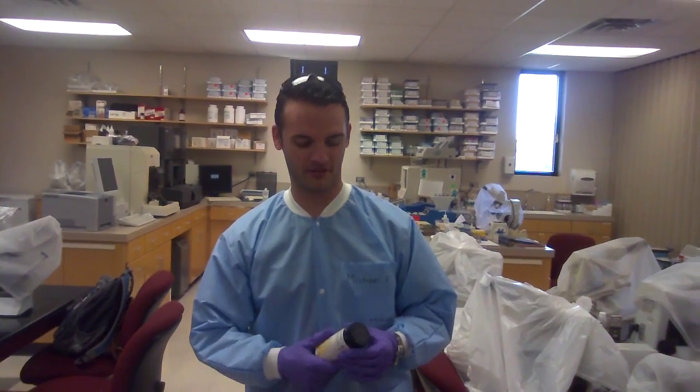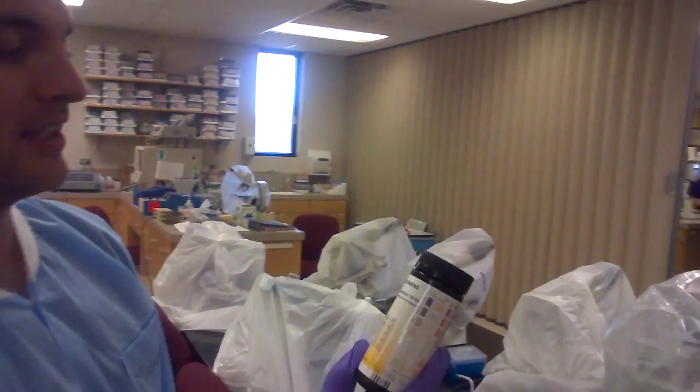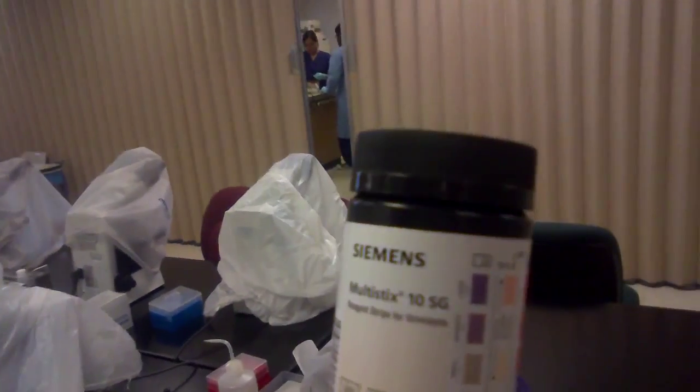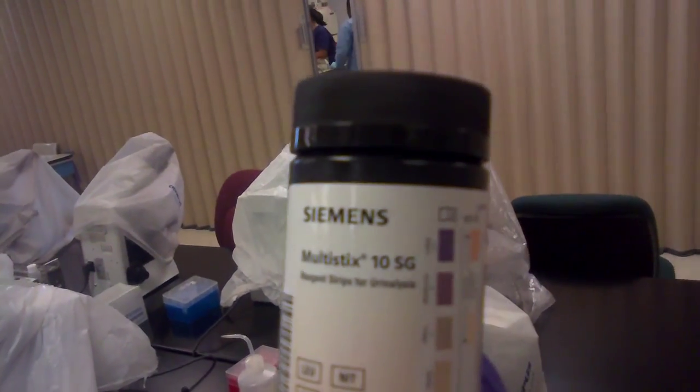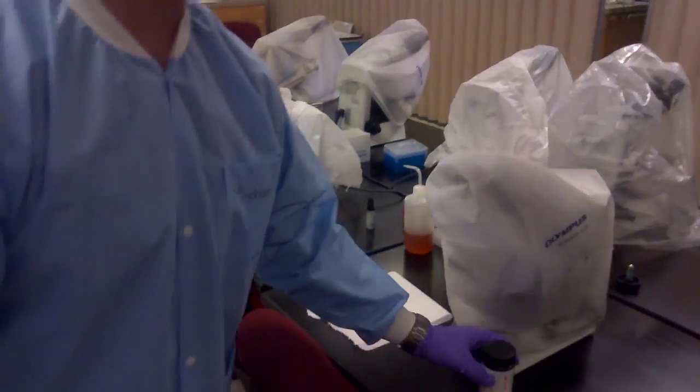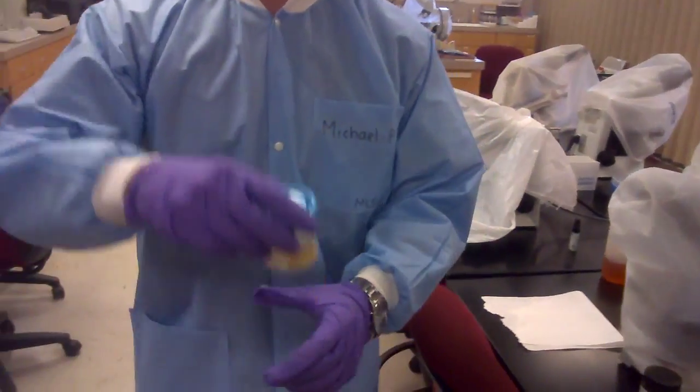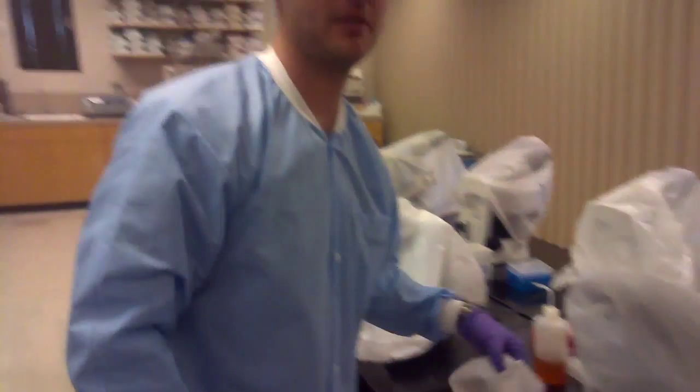it's time to grab your materials. Here is the Siemens Multi Stick Tens SG reagent strips. You need some urine and you need a paper towel.